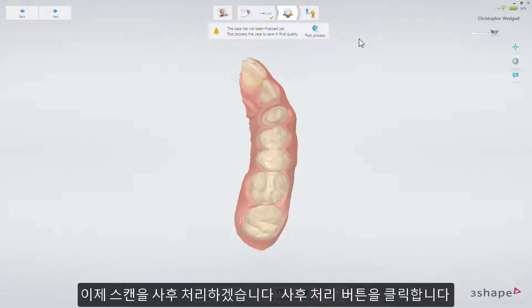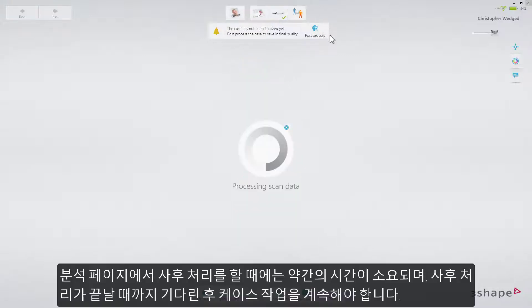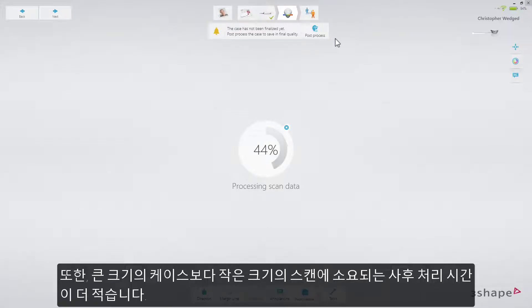Now post-process the scan — click the post-process button. Please note that when doing post-processing in the analyze step, it will take some time, and you'll have to wait for the process to finish before continuing your work on the case. The better the PC performance, the shorter the post-processing time. Also, smaller scans will require less post-processing time than large cases.